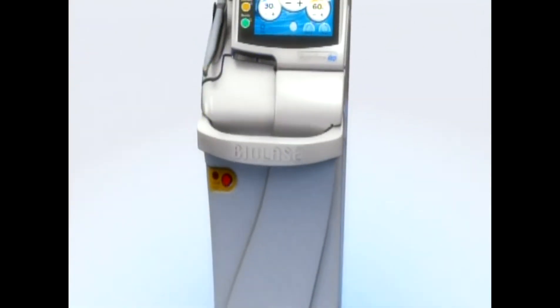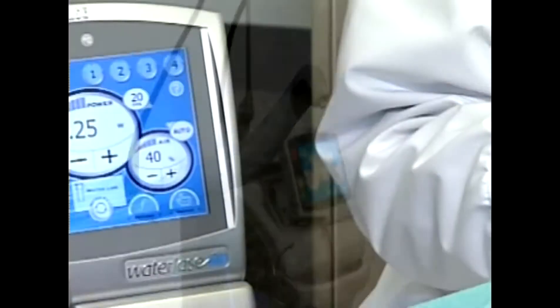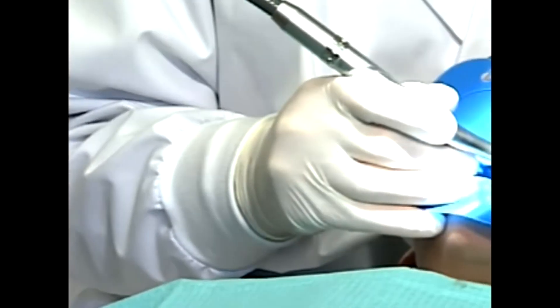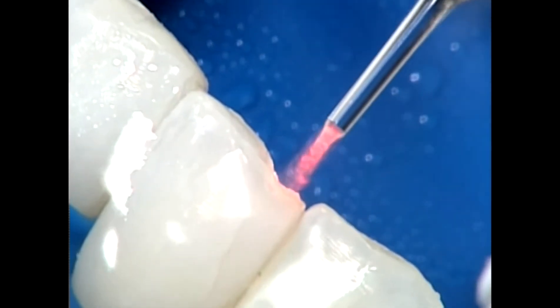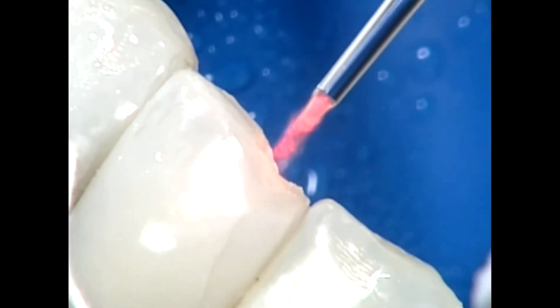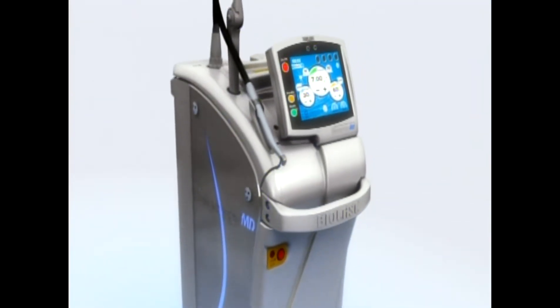Why use the Waterlase MD laser instead of the high-speed drill to do operative dentistry? Because with the laser, there is no vibration, no detrimental heat to the tooth. The laser is a gentler, better way to treat and preserve the tooth structure. The Waterlase MD is fundamentally different from the high-speed drill.